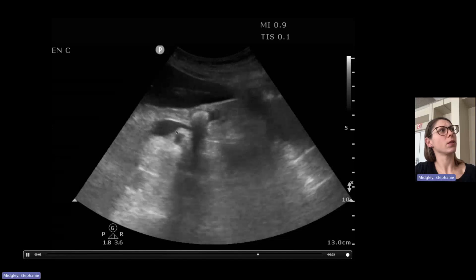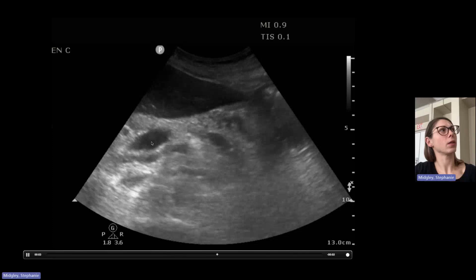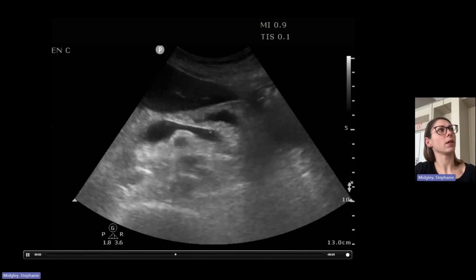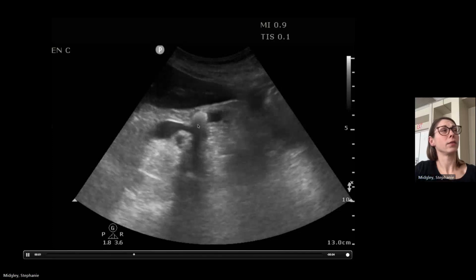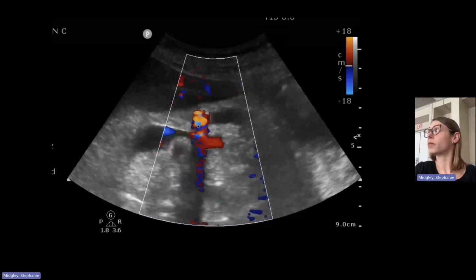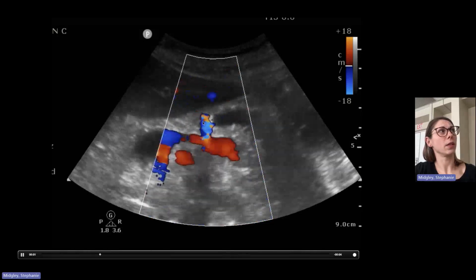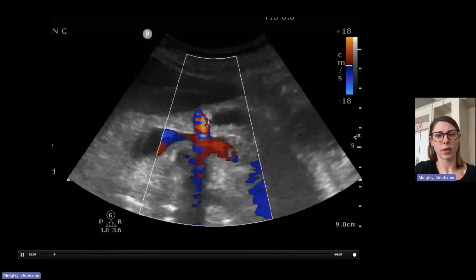So we're above the SMA. What vessels are on top? Yep. So splenic, and then there's your portal here. And then what lives on top of the splenic? On top of the splenic is the pancreas. Like stone or pancreas or shadow. Yeah, there's a stone within the pancreatic duct CBD area. Yep. And then again, twinkle artifact, so color flow on there.